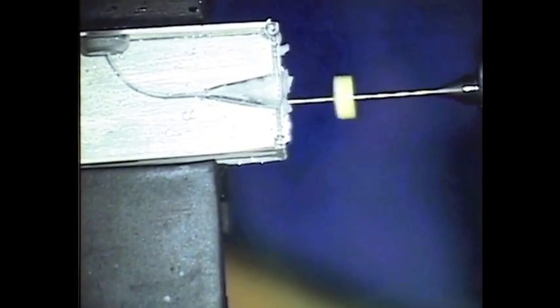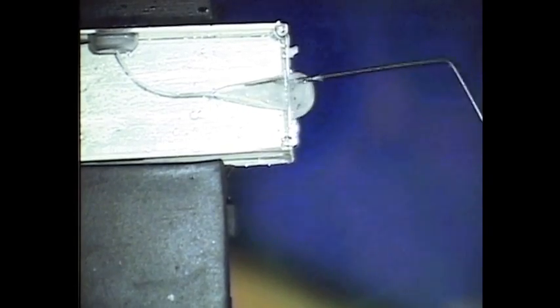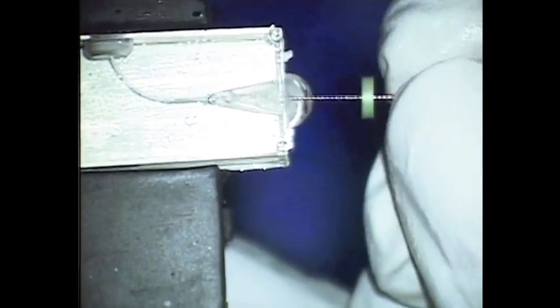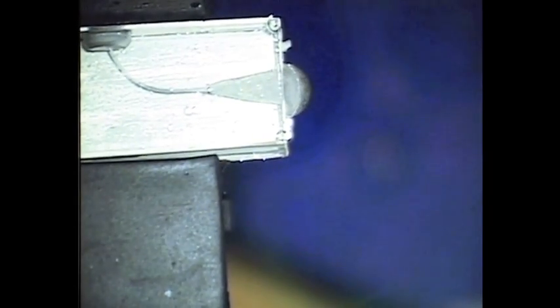I'm happy with that now. With the Gates Gliddens you should never leave them in the handpiece because you could cause a needle stick to yourself or your nurse. Then I'm going to irrigate again — just gently, and in a patient you'll have the nurse doing suction at the same time. I'm going to pick up my K-flex file and just distribute any of the debris into the solution, going a little bit further down than where the Gates went, and then irrigate again.